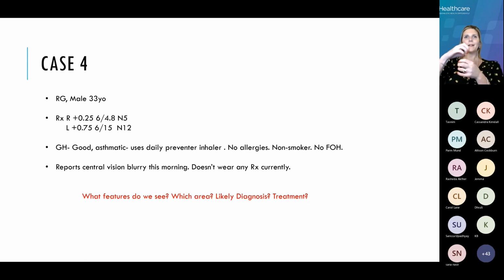Obviously, when you see something like that, look at everything else in relation, checking that nothing else is going on. But typically what you have to think about with a patient with epiretinal membranes, vitreomacular tractions and adhesions is, if they were to be seen, what would be done? What would happen to them? Because if their vision is still good, the majority of the time they would be sent back to you and looked after in your care.